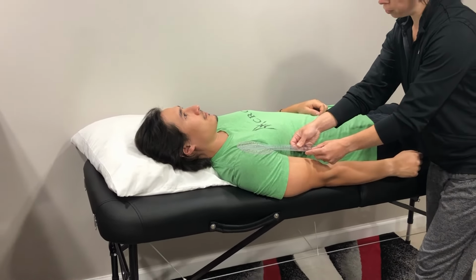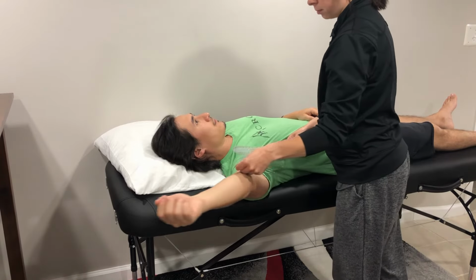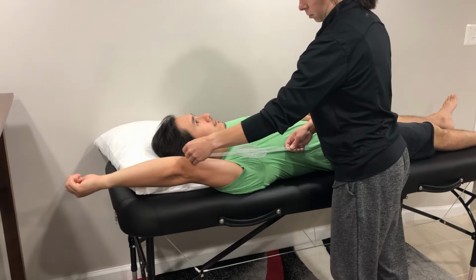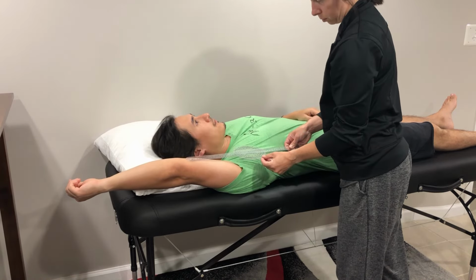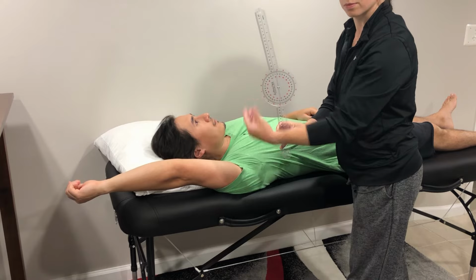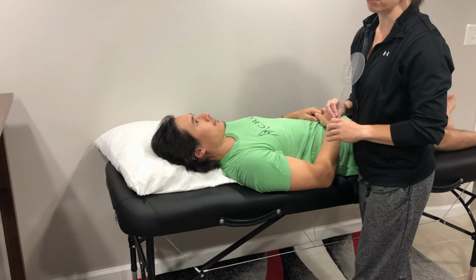Go ahead, bring your arm out to the side, and as far as you can, up towards your ear if able. And that is measuring abduction of the shoulder joint.